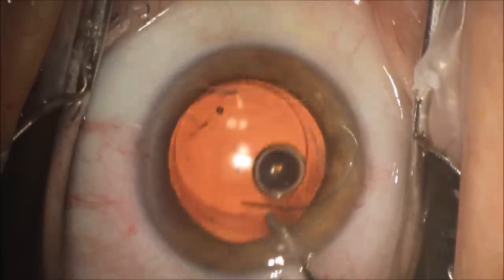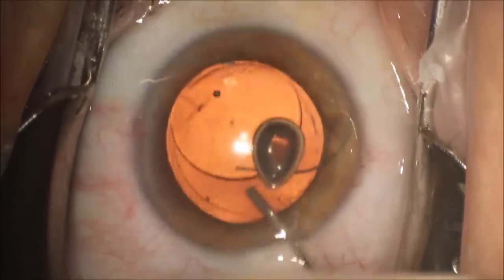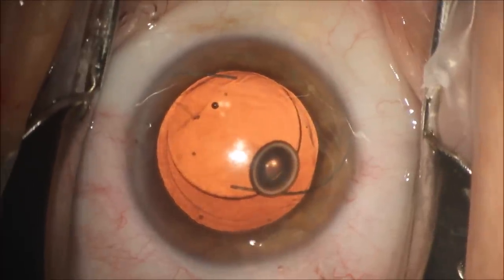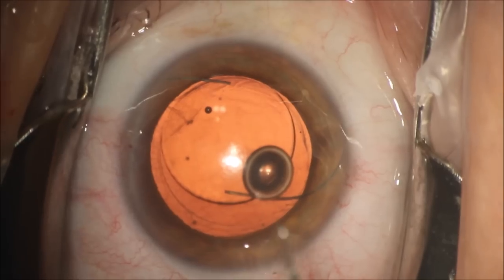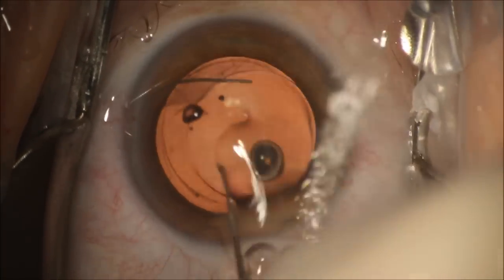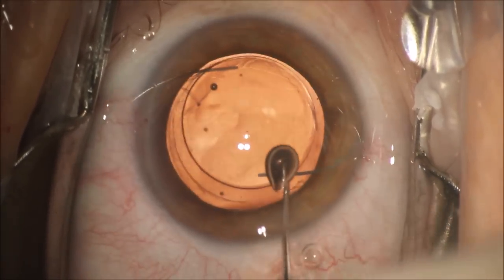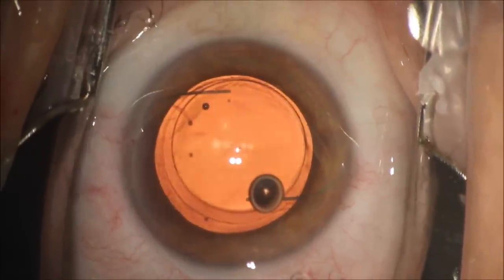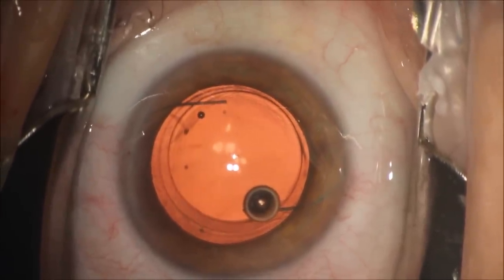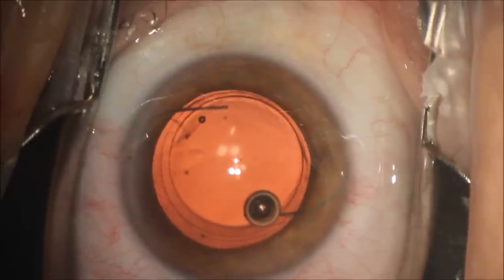We put viscoelastic underneath the intraocular lens implant and above the intraocular lens implant to give protection to the corneal endothelium. That's the very delicate cells on the inside of the cornea, and also stop the posterior capsule from being violated with the intraocular lens scissors that we're going to introduce in a second to bisect the lens.